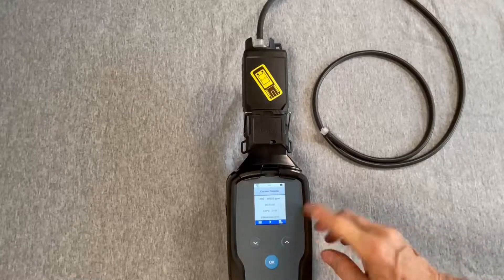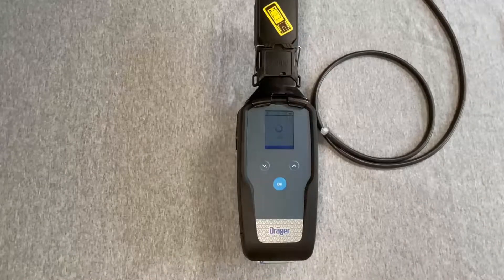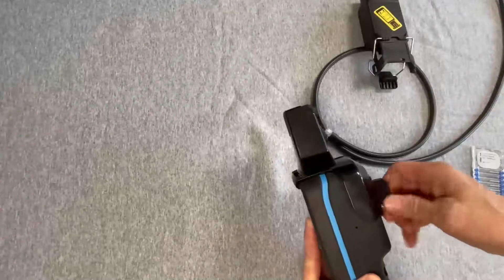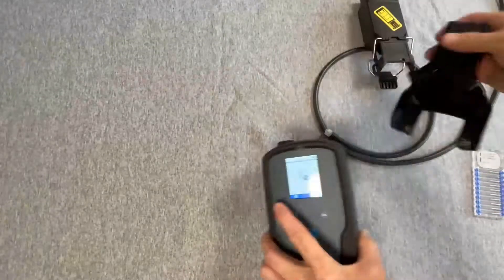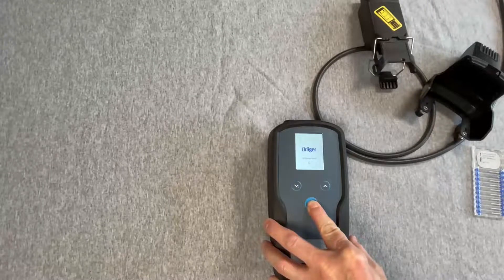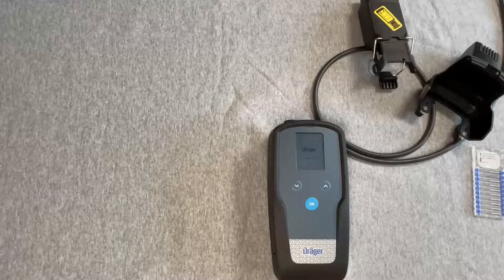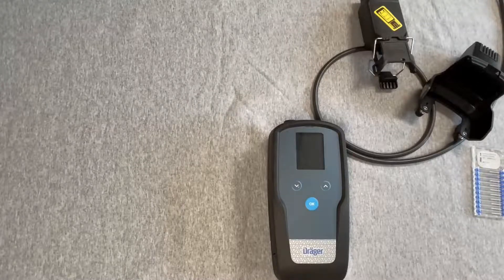After the measurement, eject the microtube and disassemble the remote system. That's the conclusion of the EXACT 7000 for remote measurements.